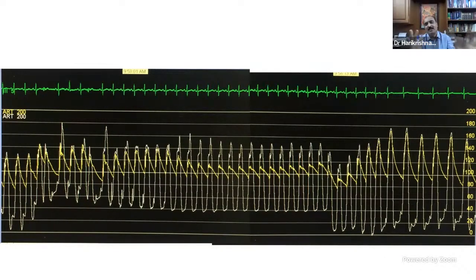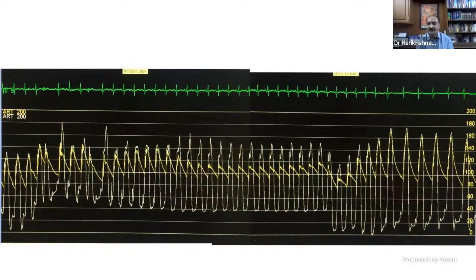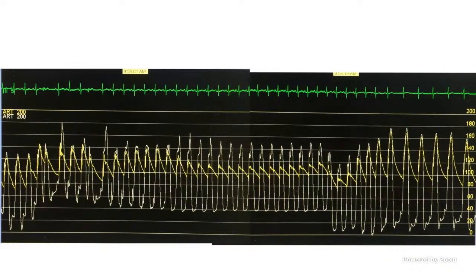No, this is taken to demonstrate something, no? We have asked the patient to do something and we record simultaneously. Some maneuver. When a cardiology consultant asks about a maneuver, you should think of something. So there is a Valsalva maneuver done, because the pressure is increased.